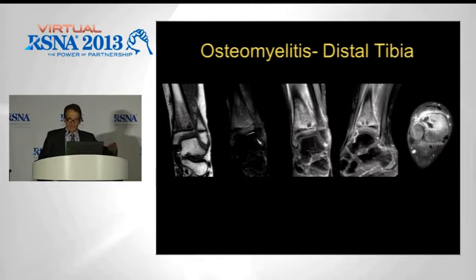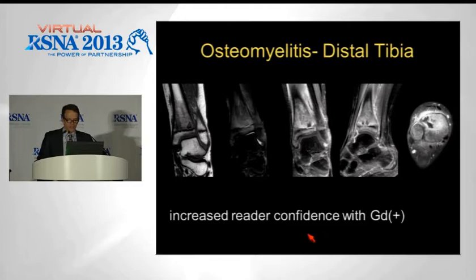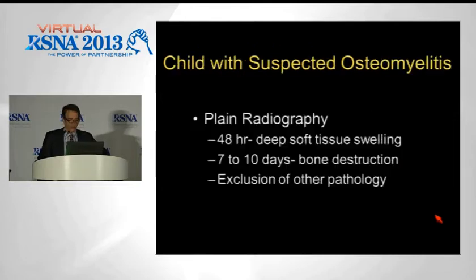When we looked at the value of gadolinium, except for the patients that have chondritis in the period of infancy, but if you look at the value of gadolinium in the older patients, you see that gadolinium does not increase your sensitivity or specificity, but it does increase the reader confidence, particularly when you are dealing with the decision as to whether you have an abscess or not.